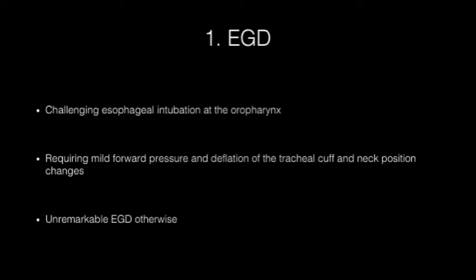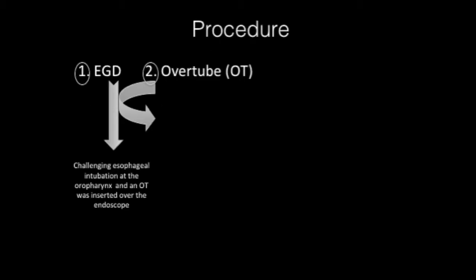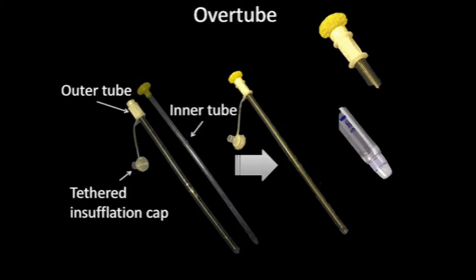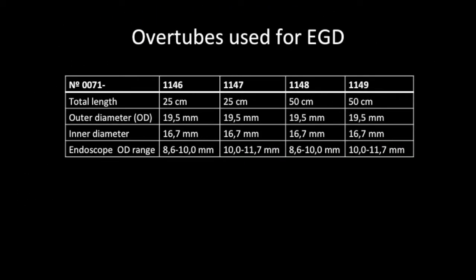For this reason, the ecoendoscope was removed and a gastric overtube was placed onto the oropharynx and through the esophagus under direct visualization with the adult endoscope.